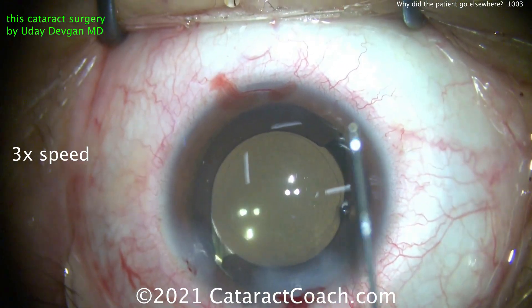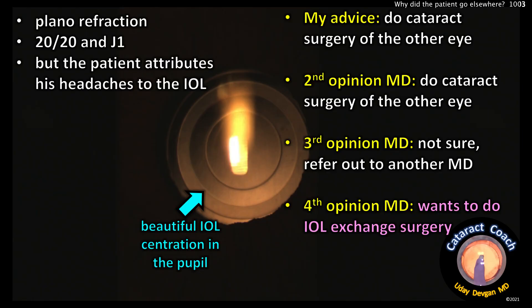Here's the outcome. Post-op, after a month of healing, the patient has an absolute plano refraction — 20/20 and J1. But the patient is having some headaches and attributes these headaches to the IOL. You can see a picture there of beautiful IOL centration in the pupil. So my advice was: let's just do cataract surgery on the other eye, because then you'll be balanced — both eyes will have the same vision. I think that'll help.